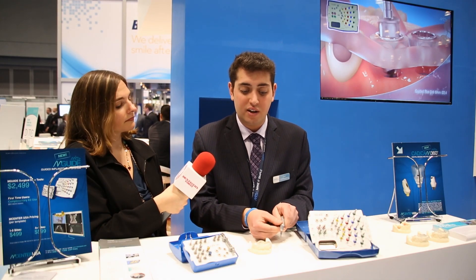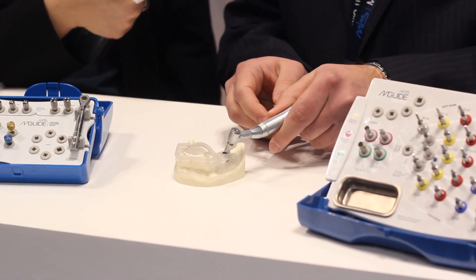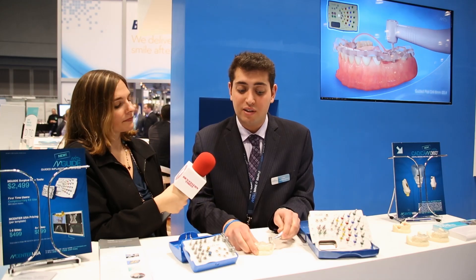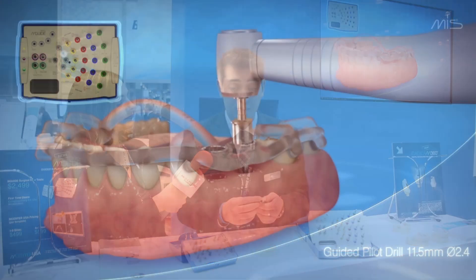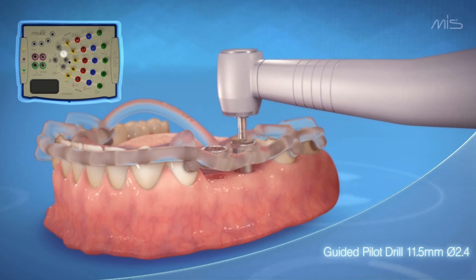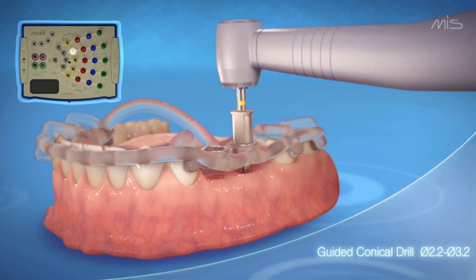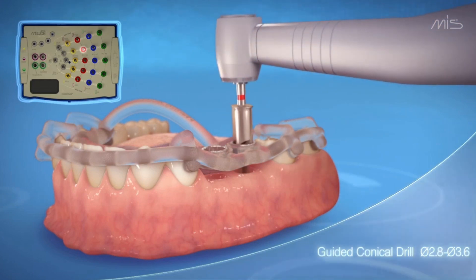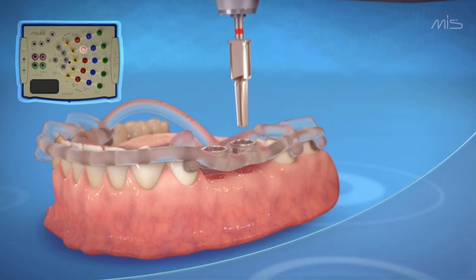No longer will the clinician have to come in overhead. We can actually swoop in from the side — the burr will center itself in the sleeve and the clinician will just drill right to the stop. This allows the clinician not to drill too deep or over prep the site. It's very simple to use. Every drill has the same centering and stopping dimensions, which means that even if we plan for a 10 millimeter length implant, we can place any other size via the same guide. The clinician does have the ability to make that game time decision if need be.